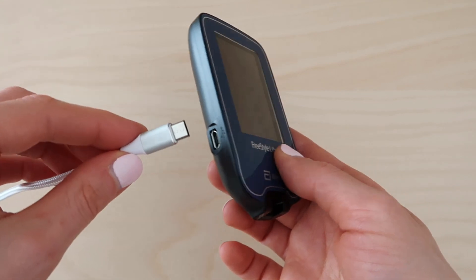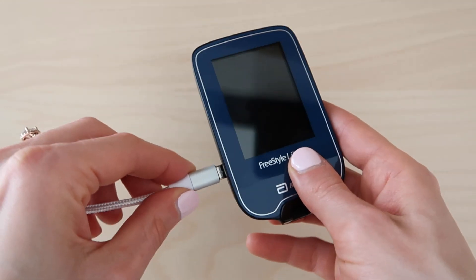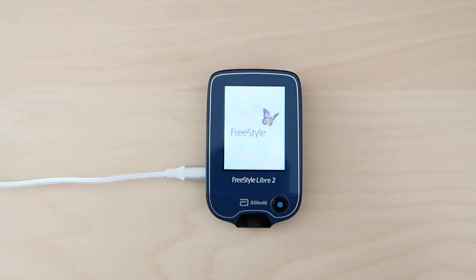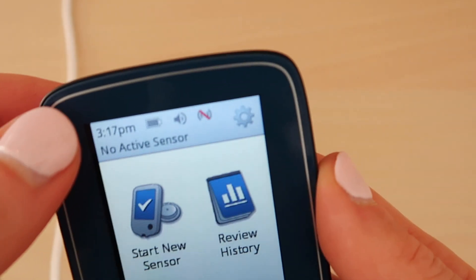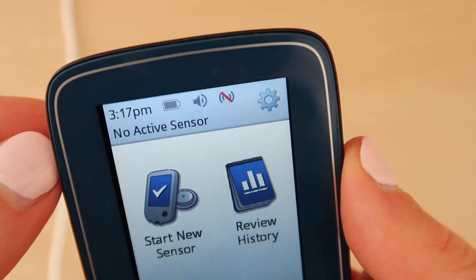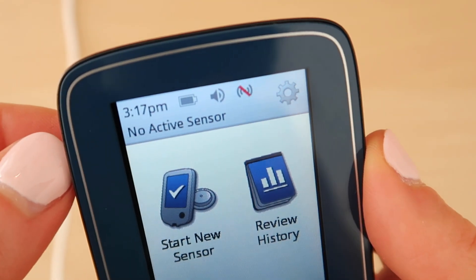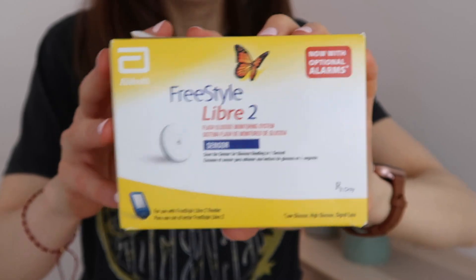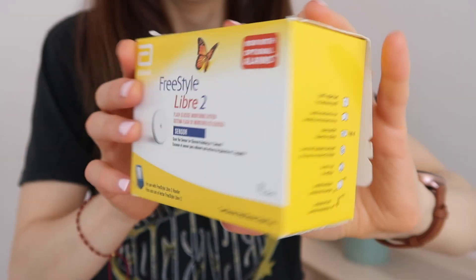I wonder if I should pop the reader on charge. Sometimes they come with a bit of charge, sometimes they don't. I'm going to pop it on charge. Going ahead and using the micro USB, we'll go ahead and plug that in. I just unplugged the cord for a minute to see what battery level we came with, and it's pretty full, to be honest. So that's good. The box with the sensor looks like this — I'm not going to turn it totally around because it's got personal details on the top.